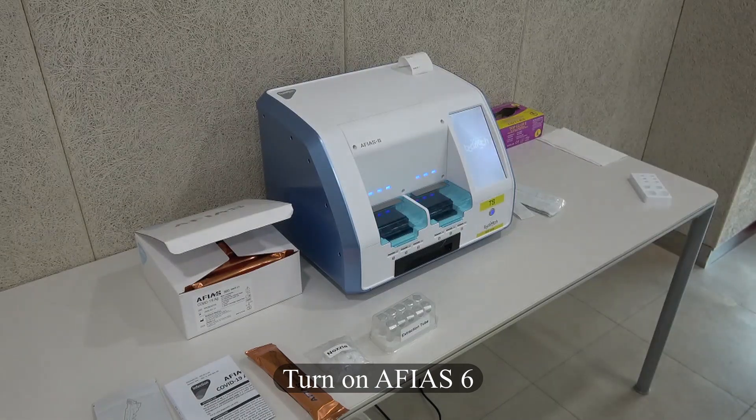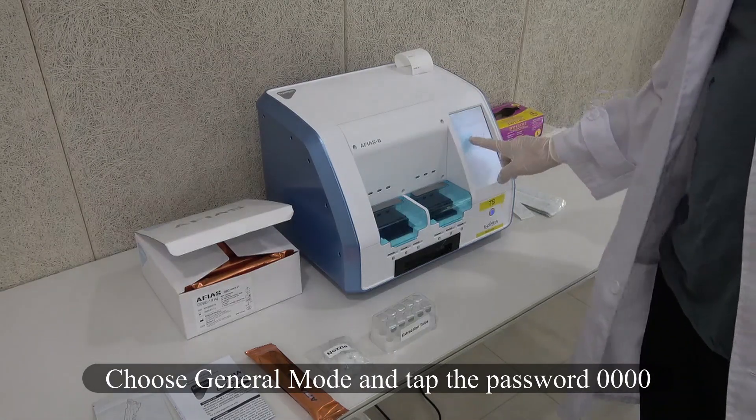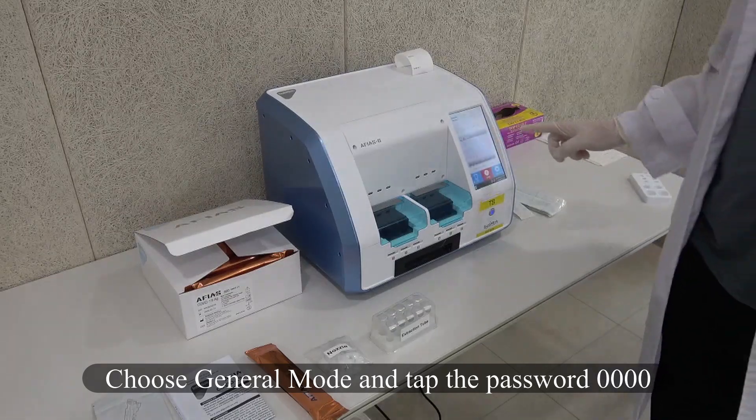Turn on the AFIAS 6 device. Choose General Mode and tap the password 0000.